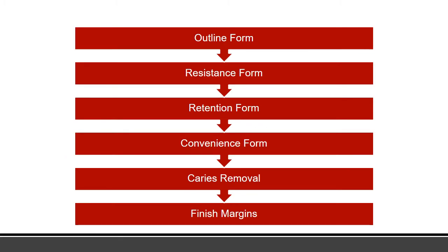So same thing, we're going to go through the same flow. You have the outline form, resistance form, retention, convenience, caries removal, and finish to margin. Same as Class 1 amalgam.